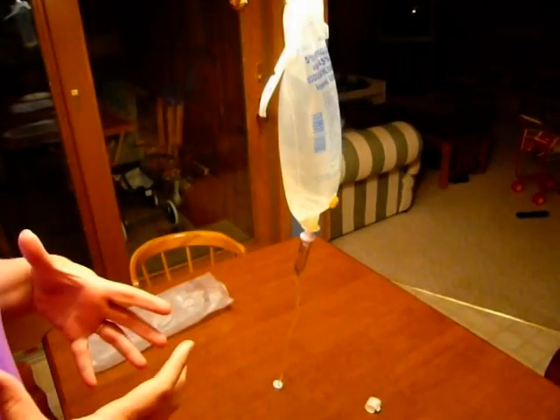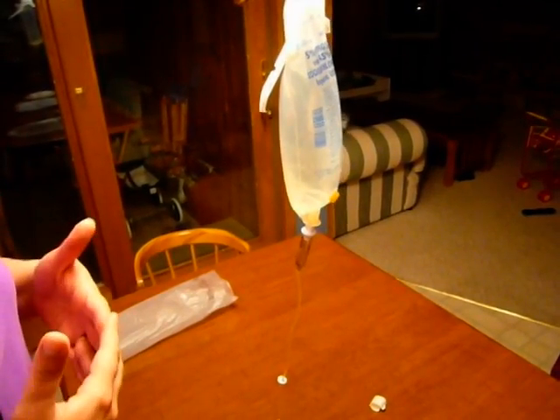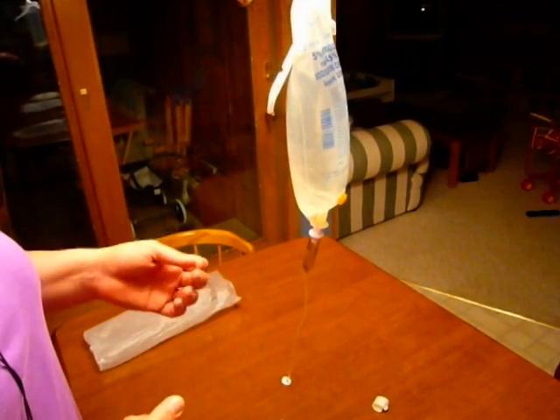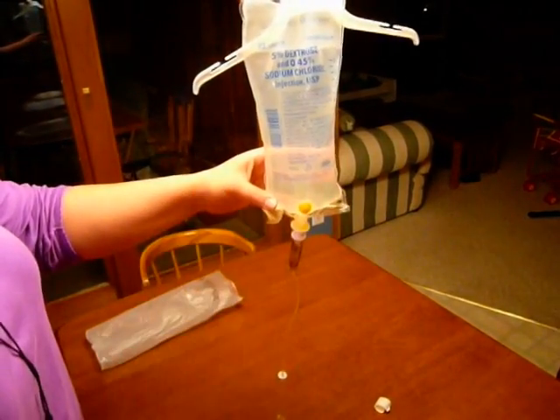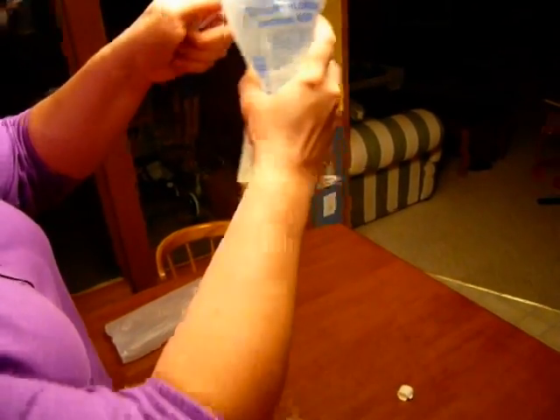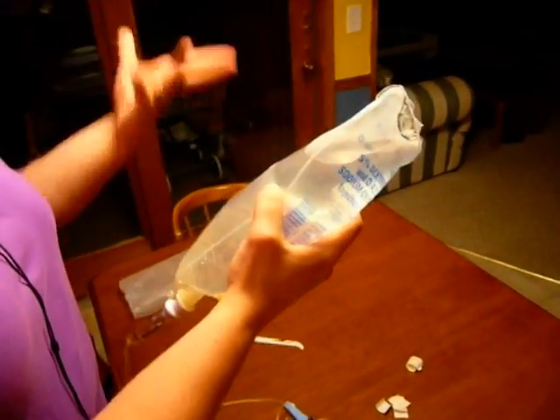Now what I'm going to show you how to do is reset the tubing so that you guys can practice at home with the priming and an IV tubing set. So what we're going to do is start with this. You have your set that you've just primed, and we're going to take it apart and reset it.